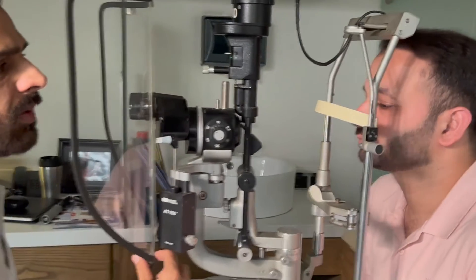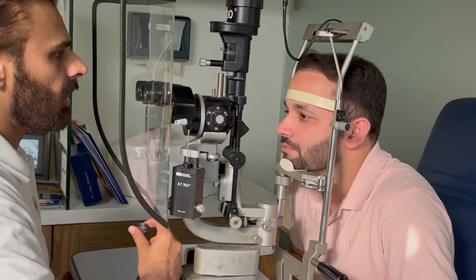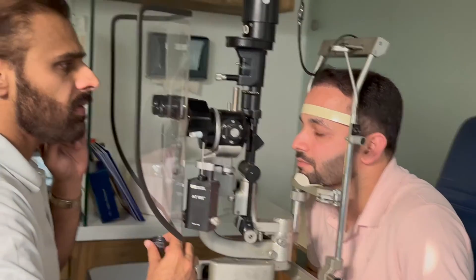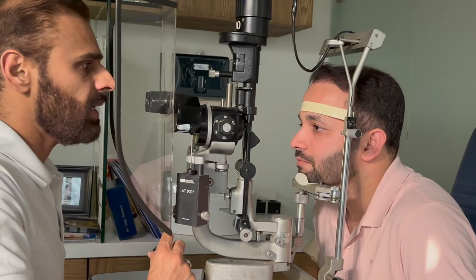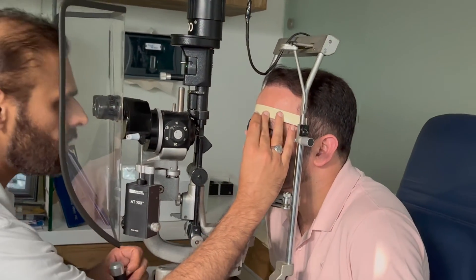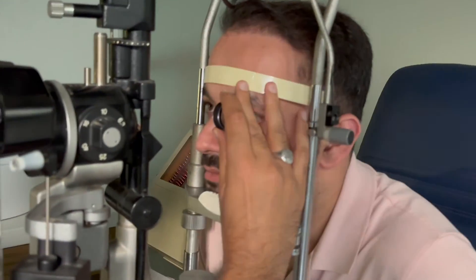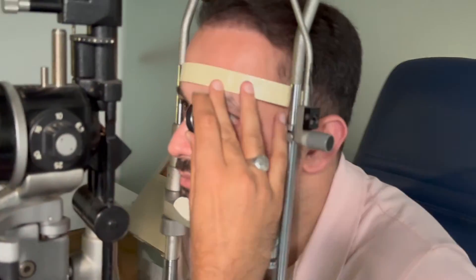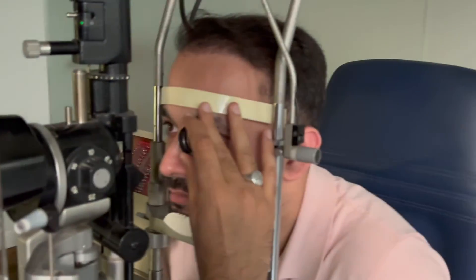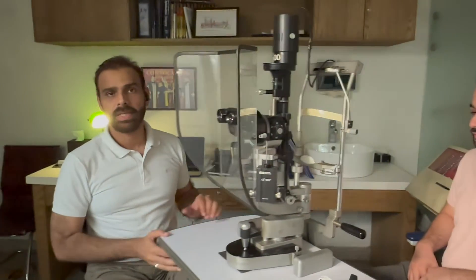Once you have completed the examination of the right eye, to examine the left eye you will hold the lens in your right hand. Ask the patient to put their chin on the rest, then ask them to look at your left ear while you introduce the lens and examine the left eye's fundus.